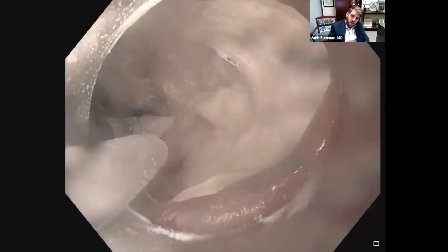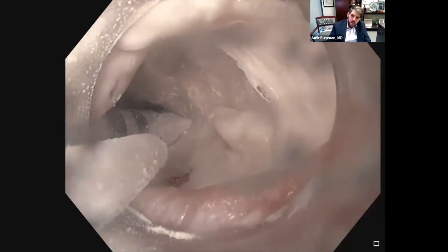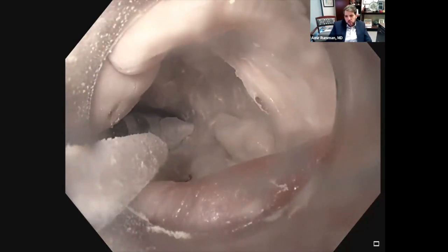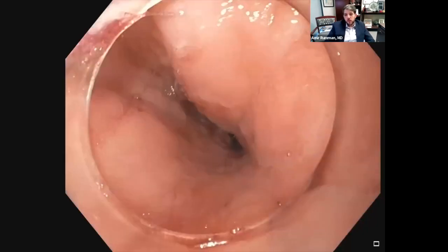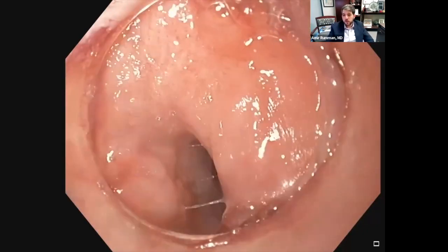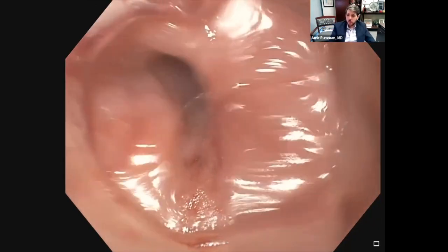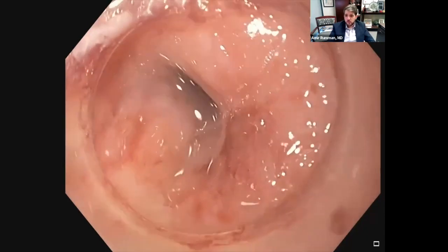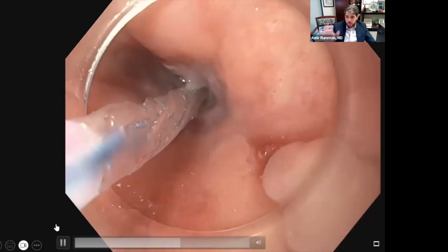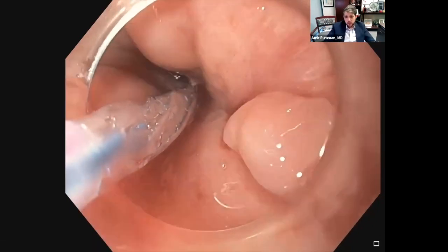This is our third application here. Another very important technical detail: I always have a distension monitor. One of our nurses or fellows, when we're applying the cryogen, has their hand on the abdomen feeling for any distension. If there's any concern the belly is getting stiff or more distended, they let us know and we immediately stop the delivery of cryogen.